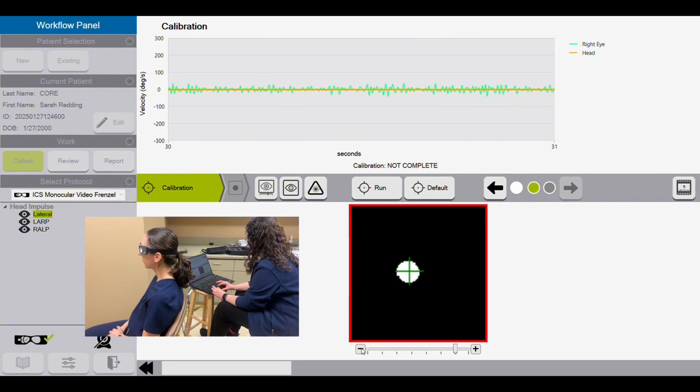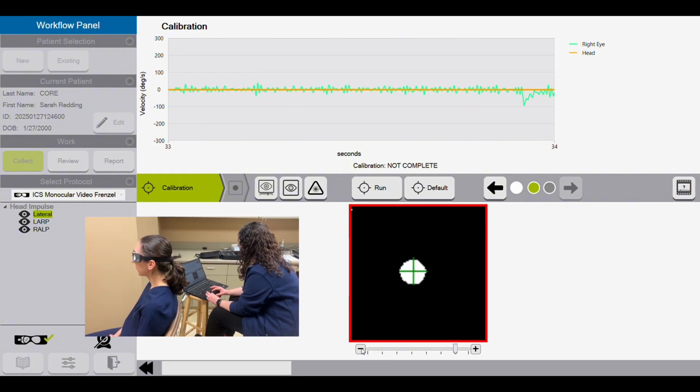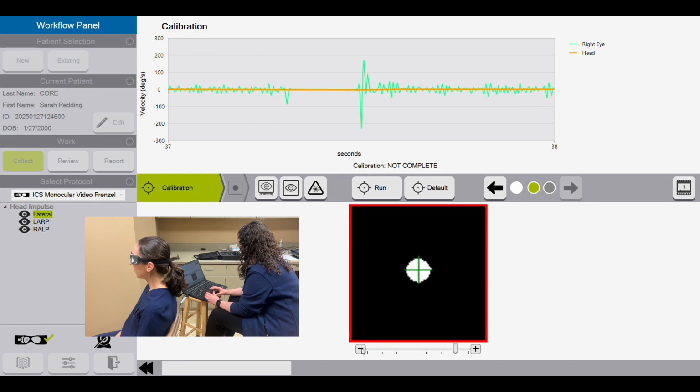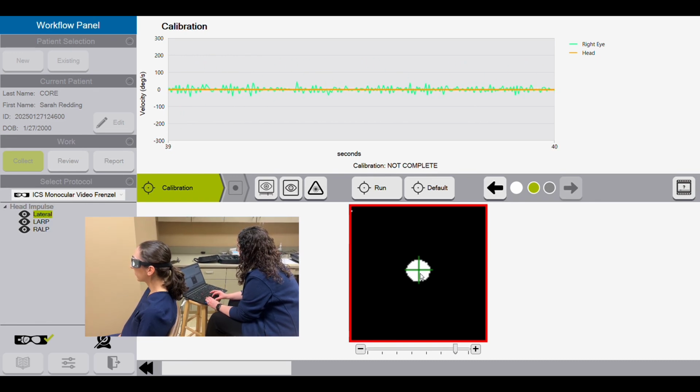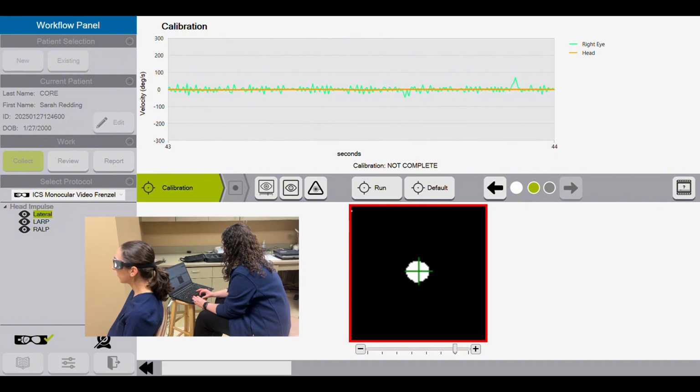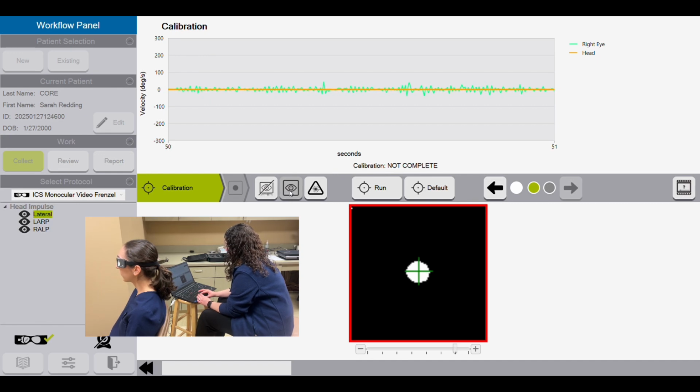And so if people have eye makeup or something, it's going to pick up on the darkest spot. So this will allow you to make a few adjustments without changing the makeup right off the bat. So we just want ideally this plus sign to be right in the middle on the pupil and not bouncing off of that. So you can adjust that if needed and as needed. So I'm just going to disable that for now and move over to the next one.